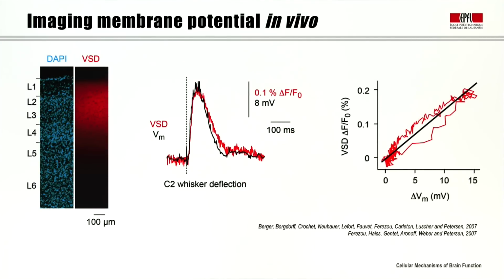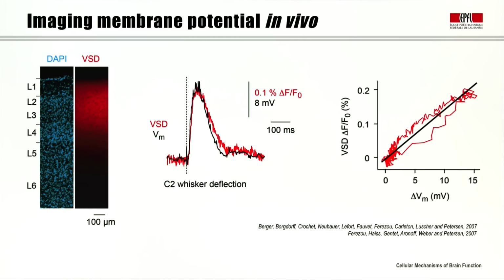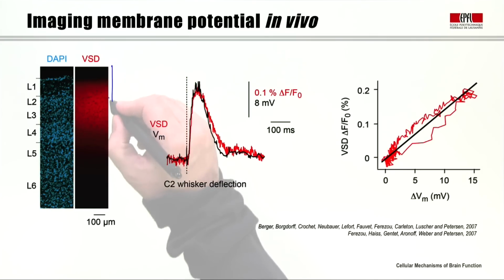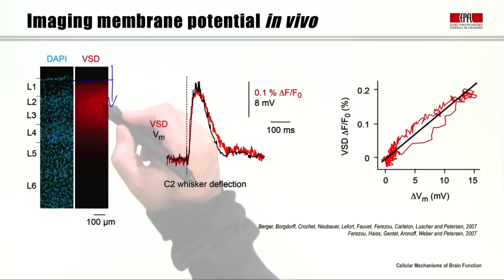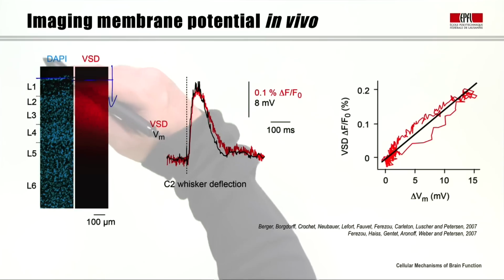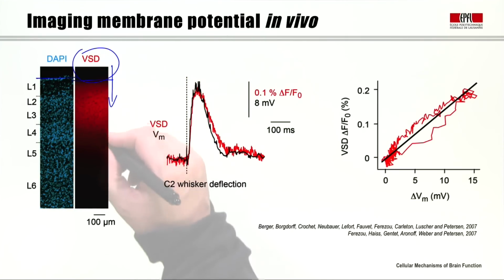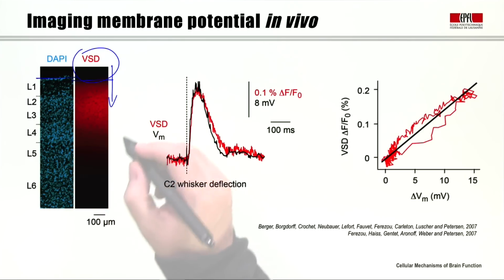However, the voltage-sensitive dye imaging technique has been applied at the level of populations of neurons, where we can stain many neurons from the outside by applying the voltage-sensitive dye from the top of the brain, allowing it to diffuse inside the brain simply through the extracellular space. So this is the surface of the brain. We have to remove the bone. We apply the dye to the surface. It diffuses in, and maybe it diffuses in the top half of the neocortex.